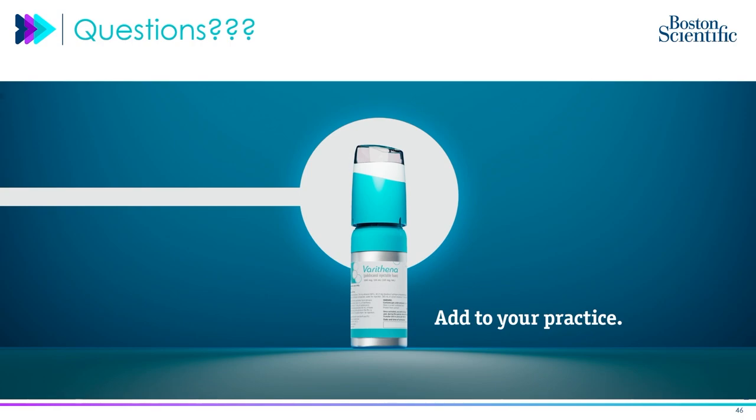I mean, you ask me, sure, one thermal versus the other. Sometimes even just having a treatment length of 10 versus 7 centimeters, I want to be done sooner. So there's really no big difference, but those little differences between one another end up dictating what you do for most of your practice. So it wouldn't surprise me that later down the line, we end up just doing Varithena, for example, or whatever new thing comes up later down the line, right?